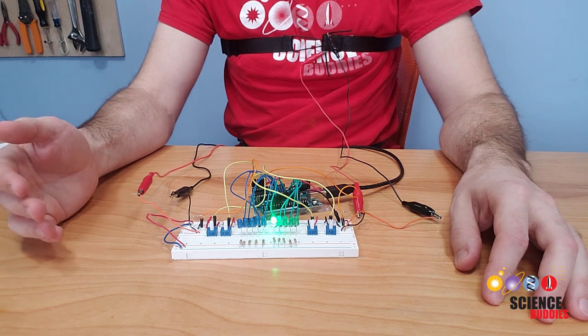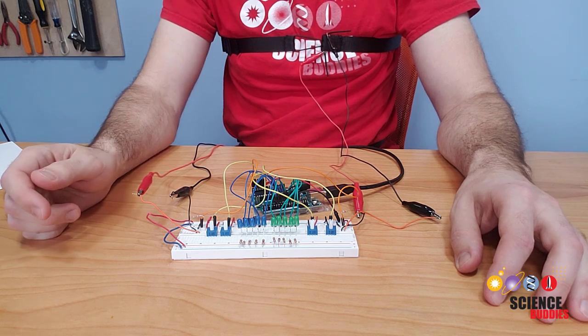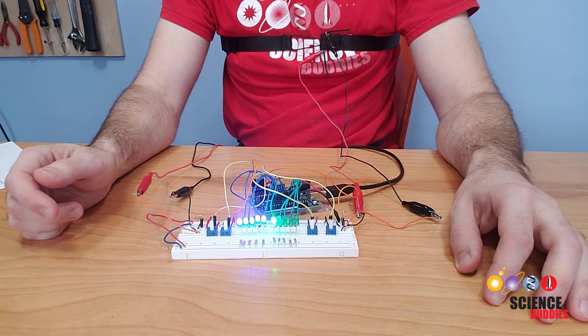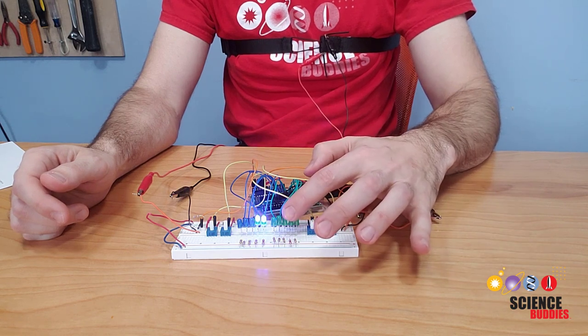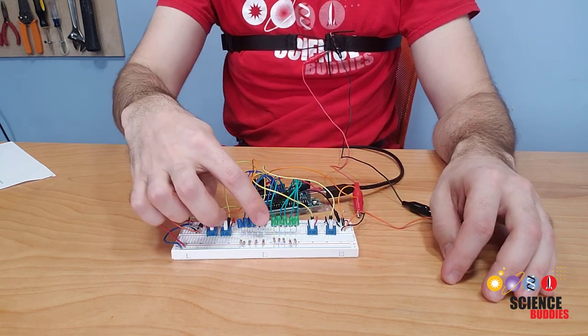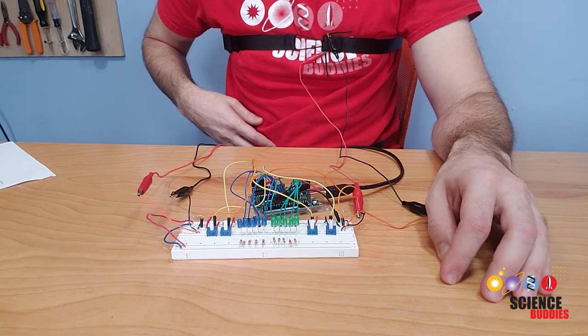Now, watch what happens when I take a deeper belly breath, which will cause the stomach sensor to stretch. You can see that I still lit up a few of the green LEDs, meaning the chest sensor still stretched a bit, but I also lit up all of the blue LEDs, indicating that I stretched the belly sensor as well.